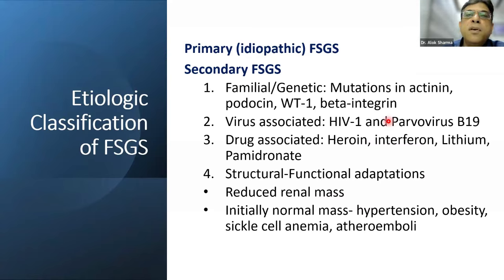That's what our final aim is. We should be helping the clinician in giving the correct treatment, not getting stuck with our own classification systems. So that is where the science has evolved now. And now all the centers across the world aim at determining whether the FSGS lesions or the podocytopathy is primary by looking at the extent of podocyte process effacement.